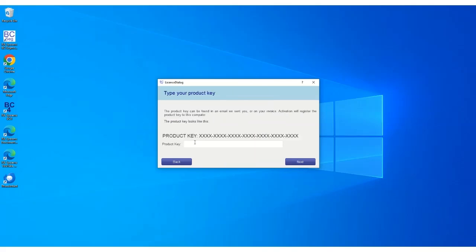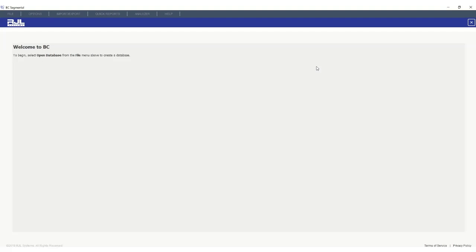Here you type or copy and paste your 28 alphanumeric product key, which you would have received as a PDF or on a sheet of paper when you received your RJL system. After you click the Next button, your program is working.